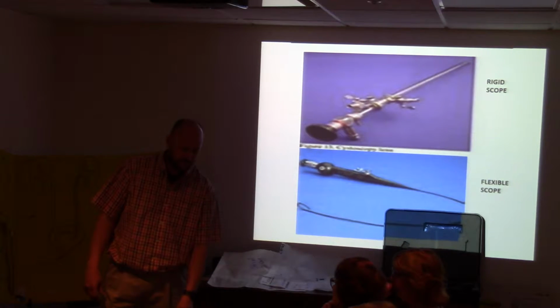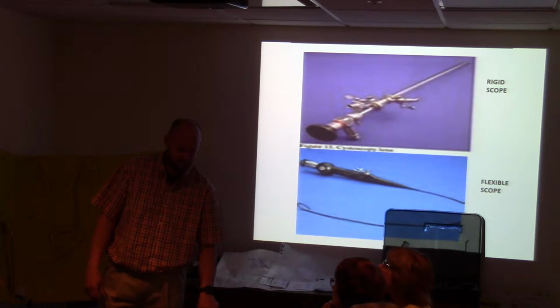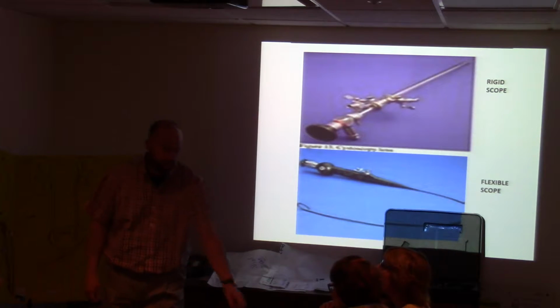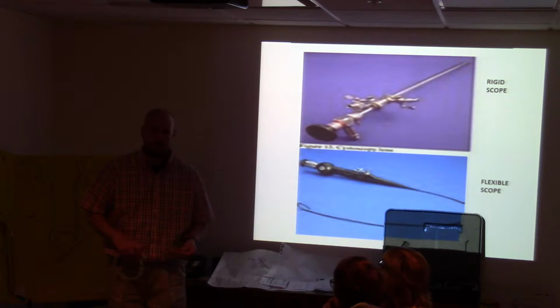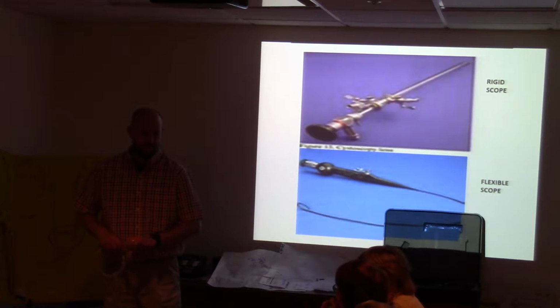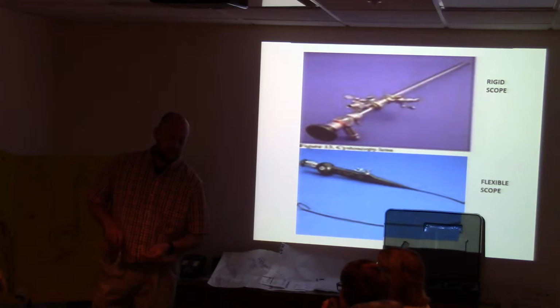Oh, okay. Do we bring these to the mobile sites? Some of the places we still bring these, like Rockford's office, and we do these procedures with the physician. So our patient care techs scrub in with the urologist and they'll hold the wire. The wires get really slippery, so when they put a wire in, we need water. So we get a cup of water. Kind of gross if I spit on it. So, when they put this wire up, it goes all the way up into your kidney.